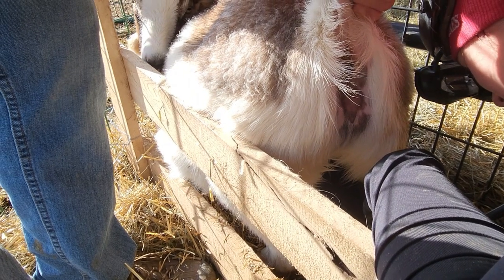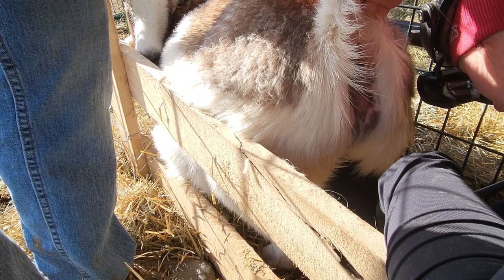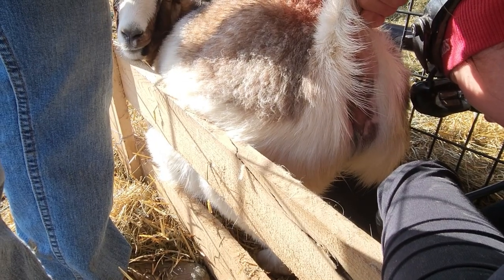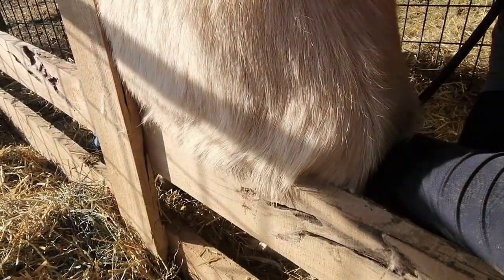These are all coming 2-year-olds. Okay, pregnant. The bottom one has a nice skull there. Oh, and I think you have a second one. Pregnant, same date, and looks like you got 2.